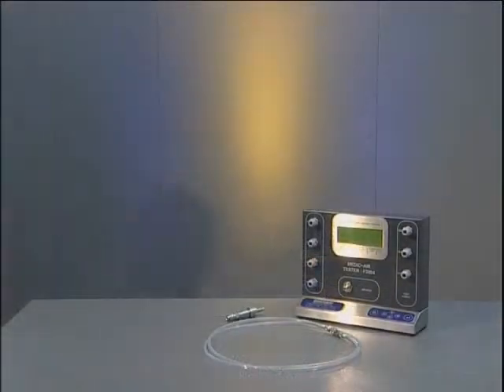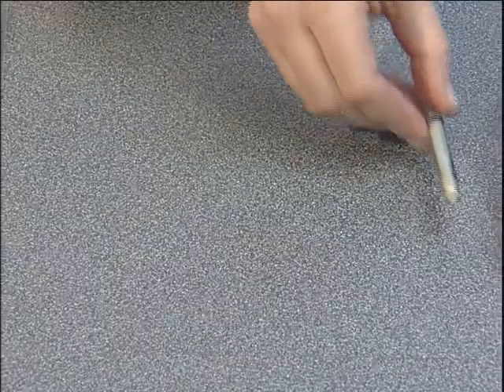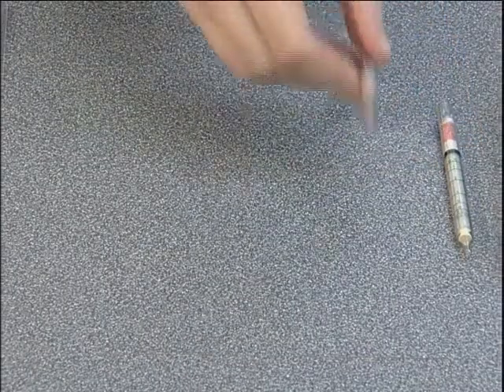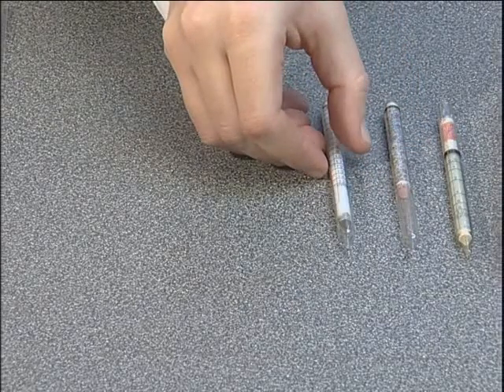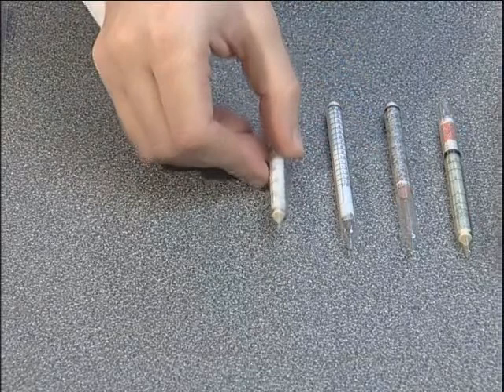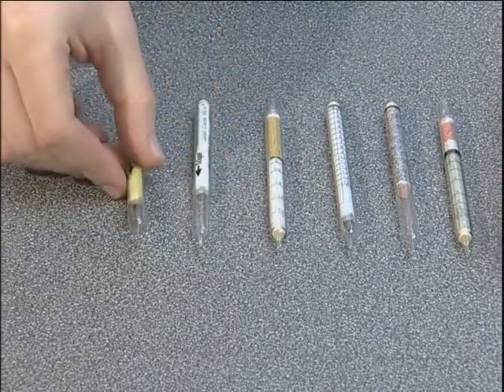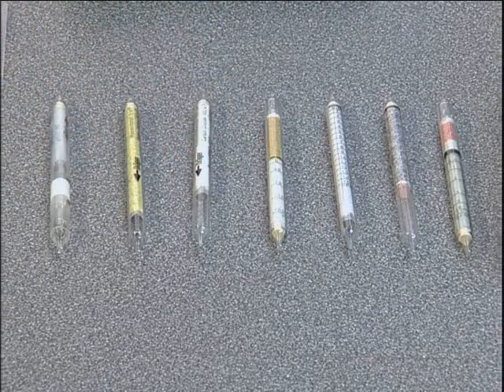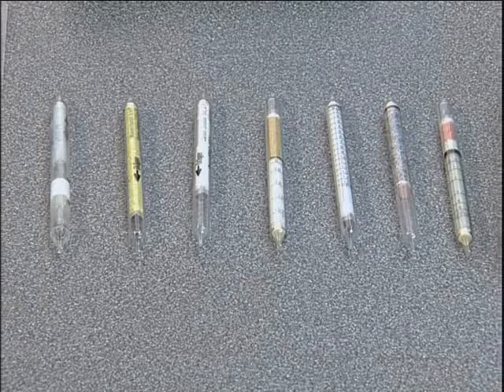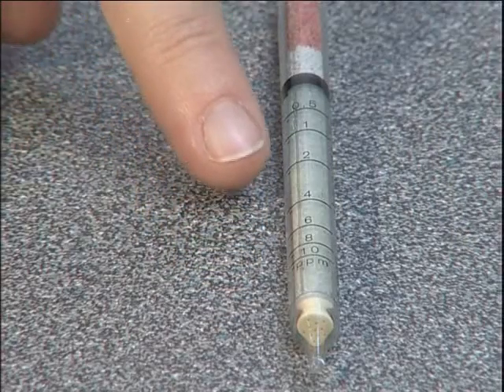The test is carried out using Draeger chemical reagent tubes, one each for nitrous fumes, sulphur dioxide, hydrogen sulphide, carbon monoxide, carbon dioxide, water and oil. These are supplied in packs of 10 per type and in most cases show the degree of contaminant present as a colour change to the crystals they contain. The extent of this is read against the scale on the tube.